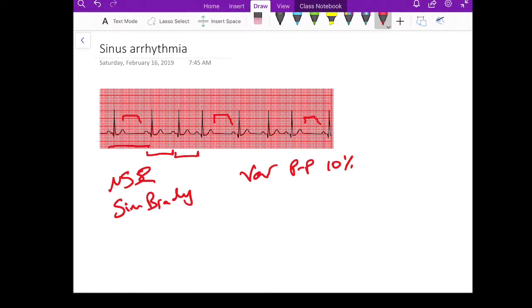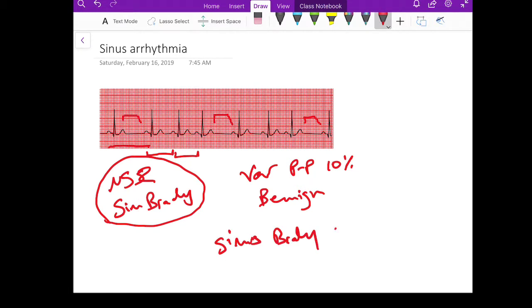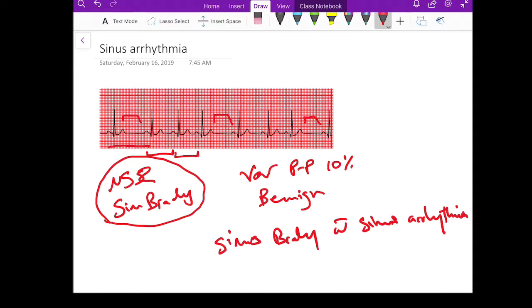We see this usually when the patient has a low heart rate, and this finding is very benign. The way to read it is to say that this patient has sinus bradycardia with sinus arrhythmia. Sinus arrhythmia happens either due to the nervous conduction of the heart changing with respiration, or due to other things — most likely it's respiration.